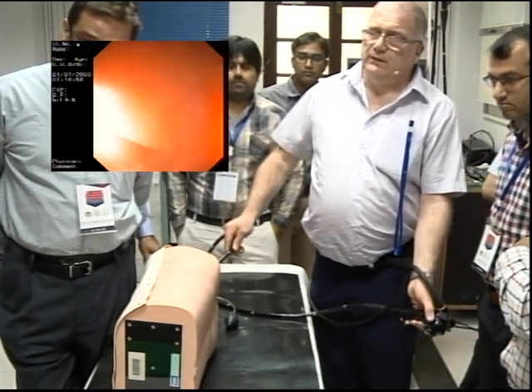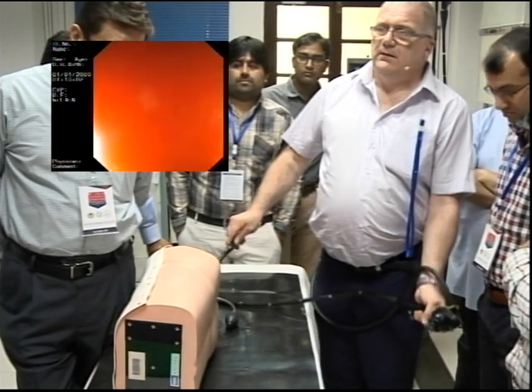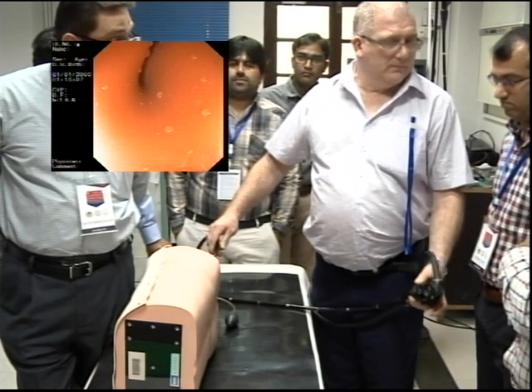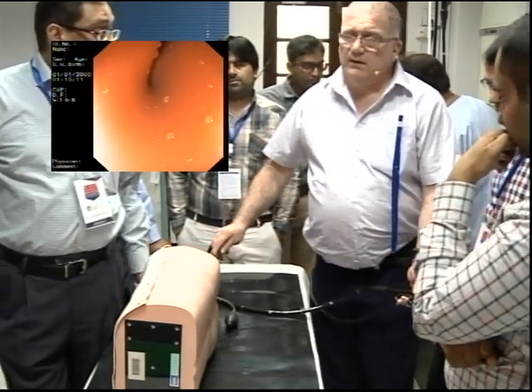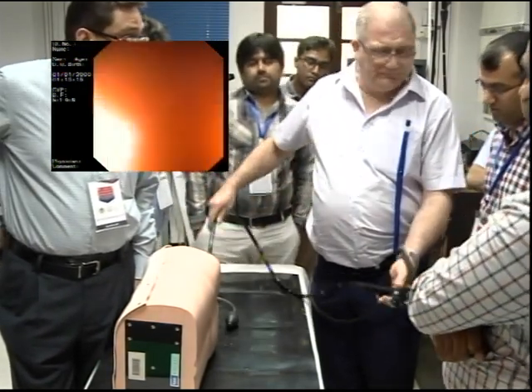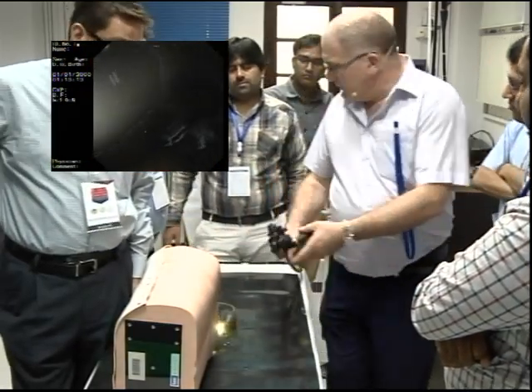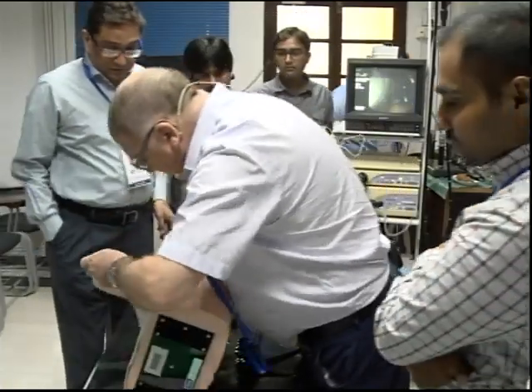Let it anti-clockwise come in. Tip up. And let the scope come back — the scope goes round. Don't open the air down here. Keeping it straight. So, so far... who's next? Hands on. We'll be right back. Thank you.